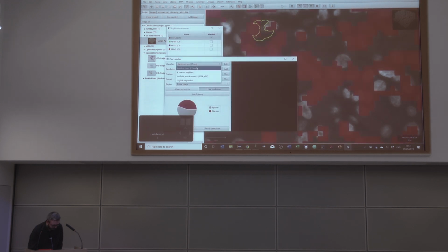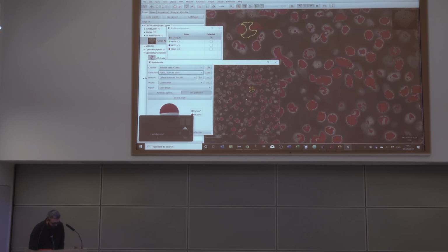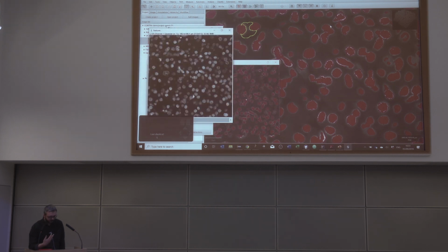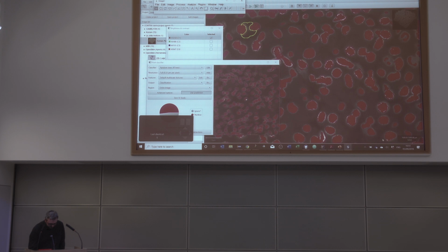It is horrendously bad at the start because I need to run at a high resolution. But now it starts to look more sensible. But let's say that, okay, I want to adapt the features. So I only give it the nucleus channel, and I want to give different kinds of features to the classifier. I can choose this. If I want to show them, I can press the show button. And this allows me to visualize the information that QuPath is basing its classification decision on.